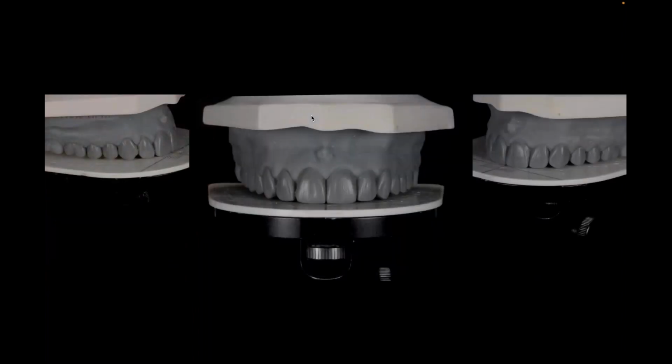So we'll do that by using my normal technique. The normal technique for us is a facial analyzer. I then want to put that on my horizontal table. I'm going to drop the table down 1 or 2 millimeters, depending on how much I'm lengthening the incisal edge. And then I'll start my wax up. That's exactly what we did here, a diagnostic wax up to the horizontal plane that we wanted, and to the gingival position that I would like to create.